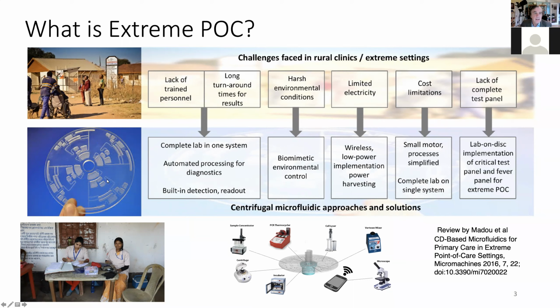By the way, here you see the disposable, right? This will be our compact disc, and this actually has the design for the very test we are talking about today. And as we go along, I hope I will be able to explain how these channels and chambers in this plastic disposable will allow you to read the identity of the microbes you identify, and also let the doctor know what antibiotic to use. So, getting back to challenges and how to tackle them.